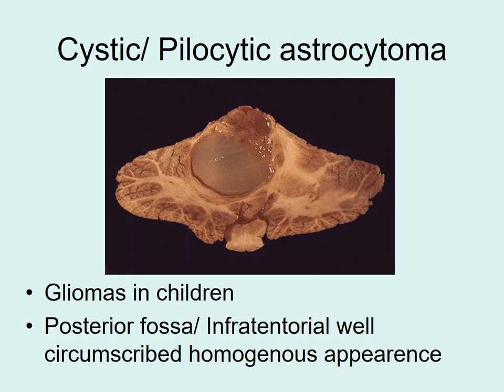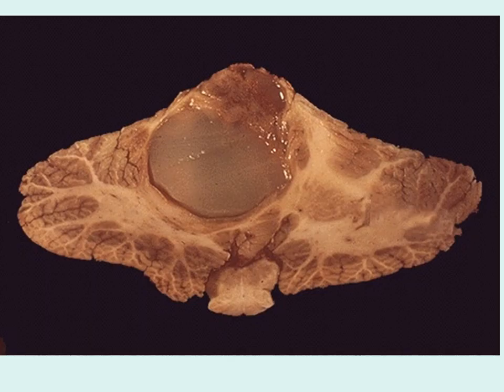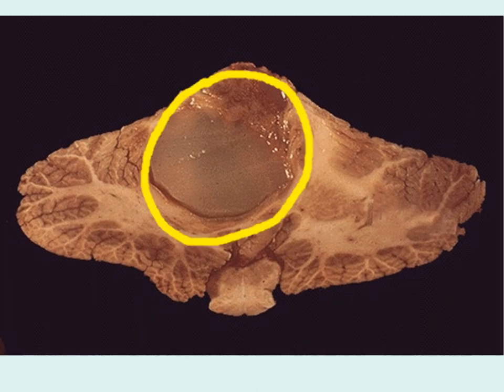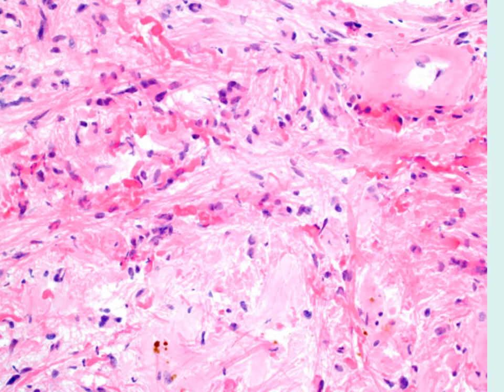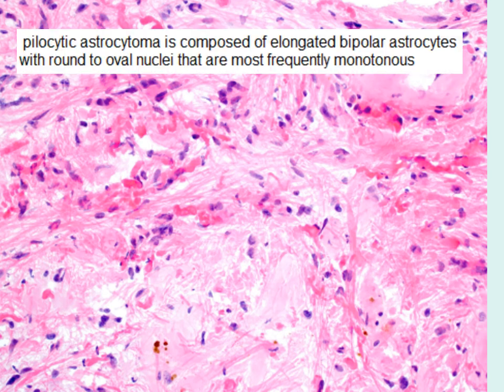Next is cystic or pilocytic astrocytoma. These are usually low grade, mostly occurring in children, and they occur in the posterior fossa. Examining it closely, it is well circumscribed with round margins and is homogeneous — the cut section has the same consistency and color throughout. Microscopically, there is very low cellularity with bipolar astrocytes with round to oval nuclei that are mostly monotonous, with no pleomorphism.